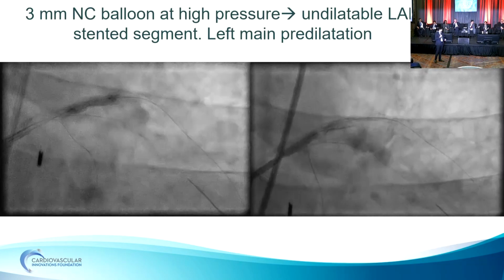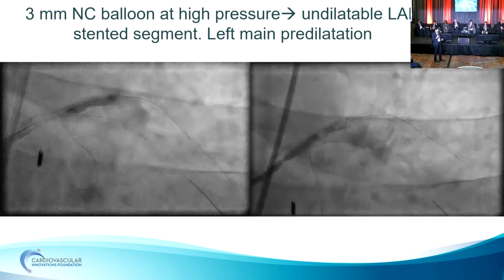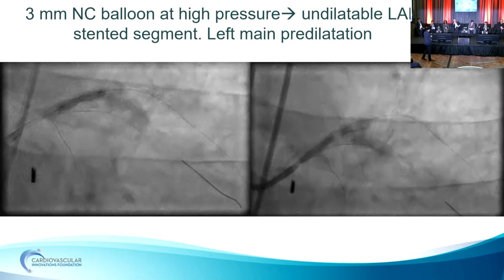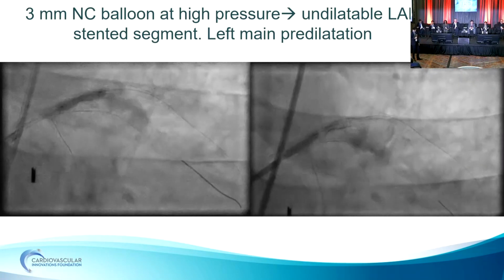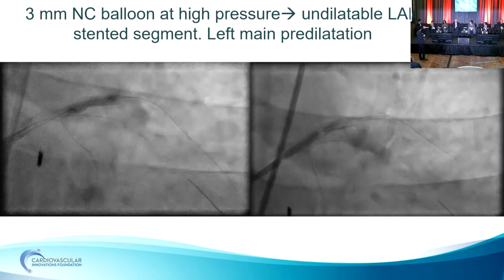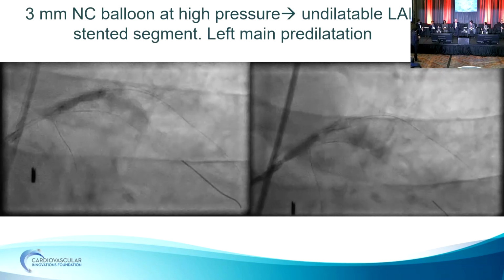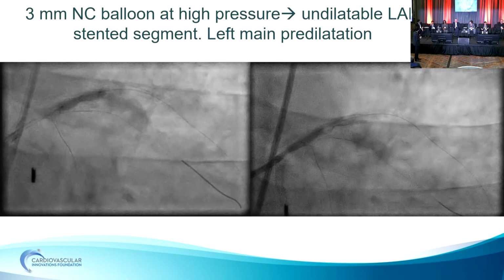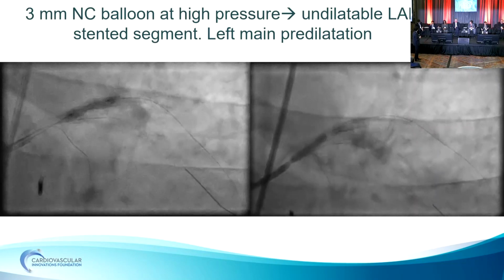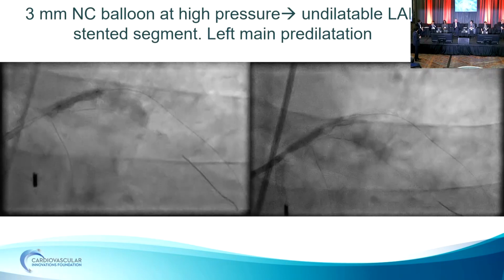Is it one stent layer or two stent layers? One stent. So maybe we can talk over here. So Ami, what would you do? What I've done for underexpanded stents like this is laser, I've done quite a bit. In my experience, laser, especially if done with contrast, gives us the opportunity to re-expand these underexpanded stents. But there is also a risk of slow flow with laser and contrast.